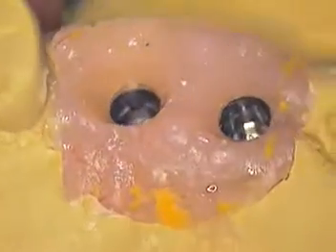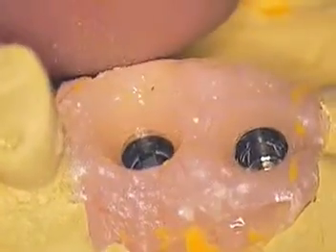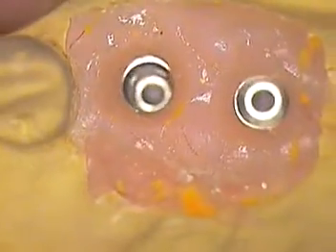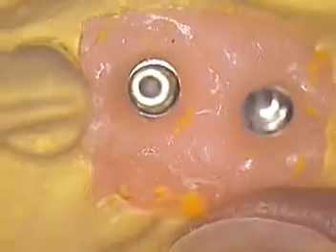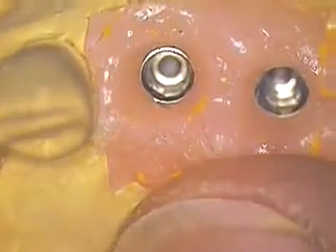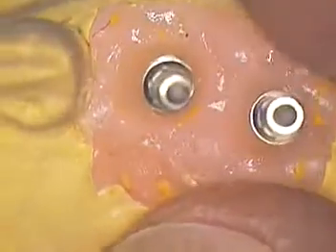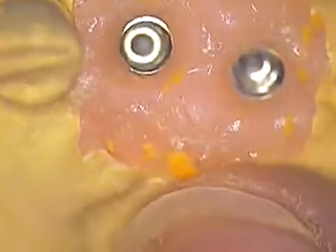A little bit about the soft tissue — you can see none of it has collapsed. We've got a nice crest area to develop. We can make our abutments from here. Whether we decide to use the stock abutments that are available, which can be somewhat modified and angled, or elect to go to custom abutments, is a decision that we'll be making in the next week.